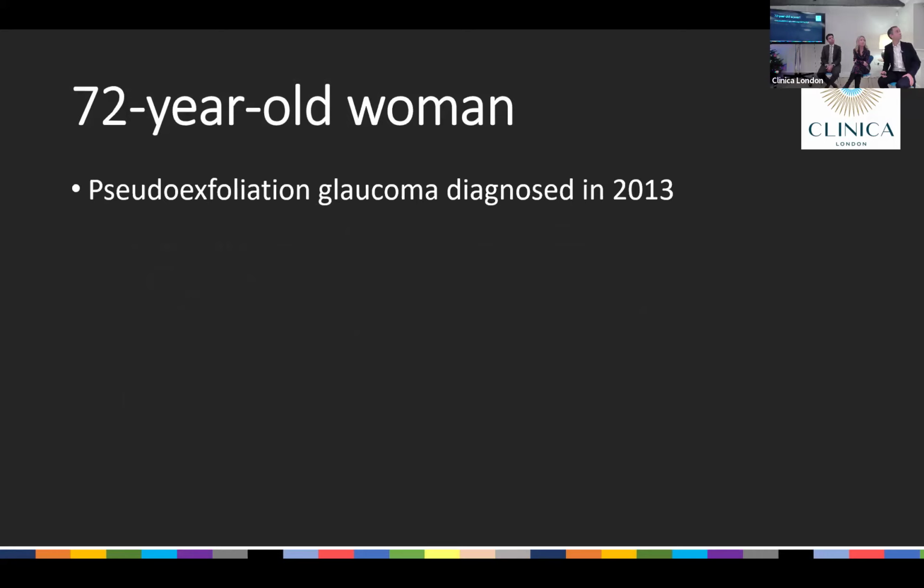So my question is, because we know that there's an age-related decline in the OCT-RNFL, if both the left and the right eye showed some decline that was quite symmetric, would you then be more reassured, assuming the visual field was totally normal, just to ascribe that to the OCT age-related thinning? And how much would you say is normal age-related thinning over time? Luckily, it plots it for you.